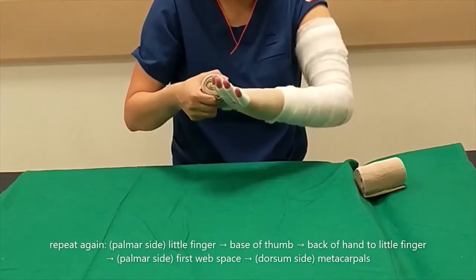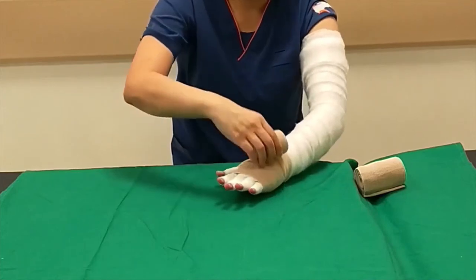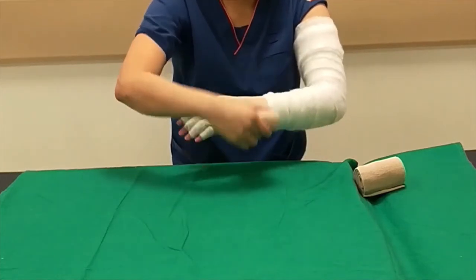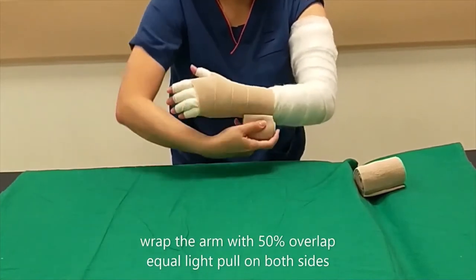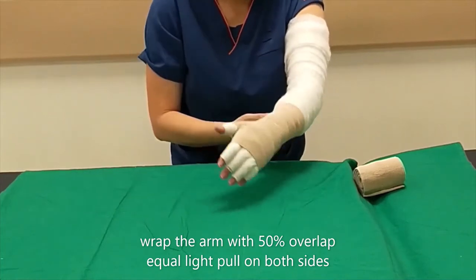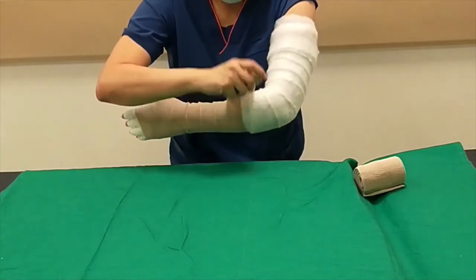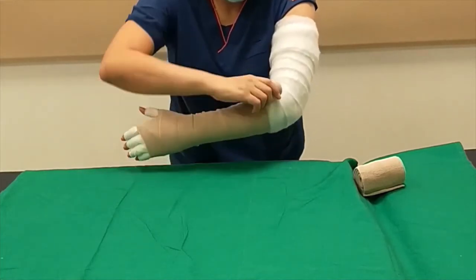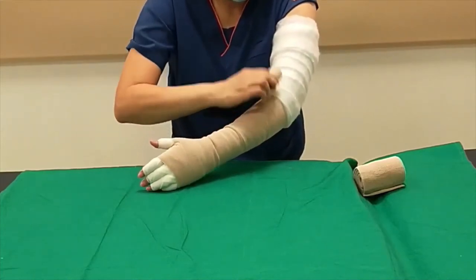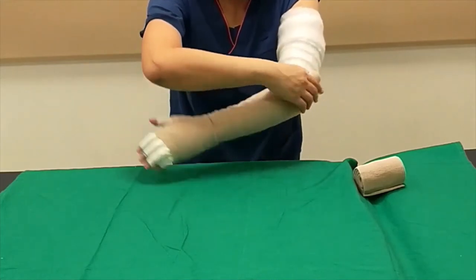Repeat the same manner for another round. After surgery, apply only light pressure. The rest of the bandage is wrapped up the arm with 50% overlap and equal light pressure. The elbow is flexed from 30 to 40 degrees to maintain functioning of the arm.